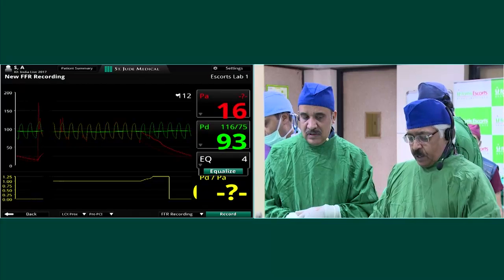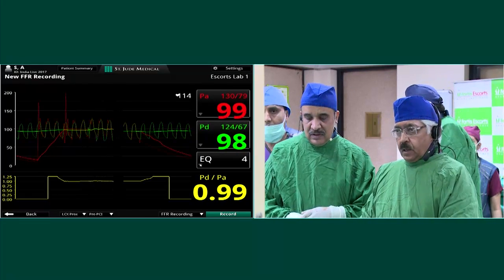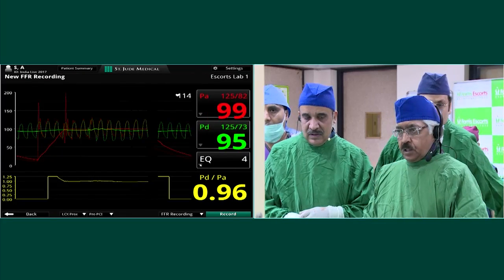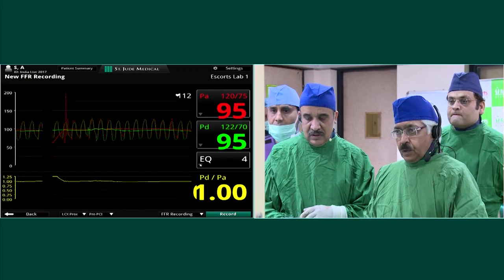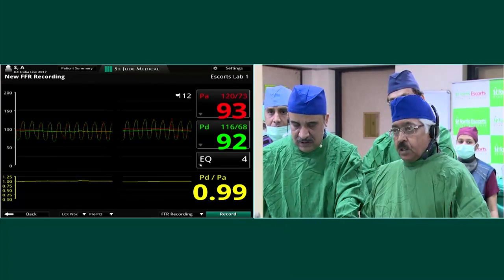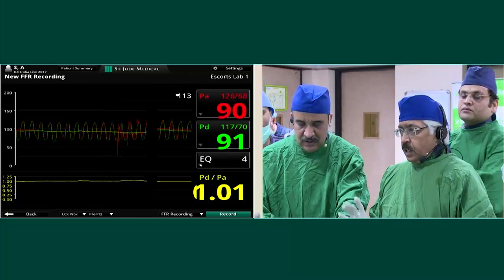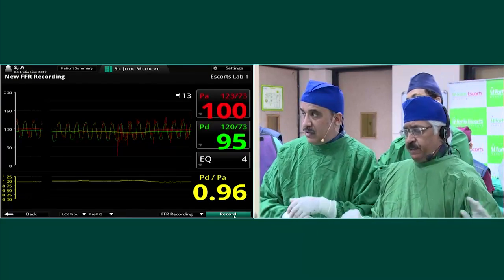And now again we'll go back. We've gone into the circumflex, into the large circumflex, not into the small one. Good. And now again we'll start the infusion. We've got a baseline of 0.95. Infuse.